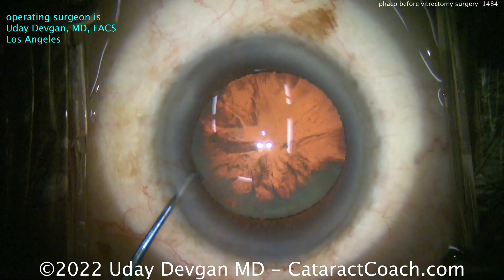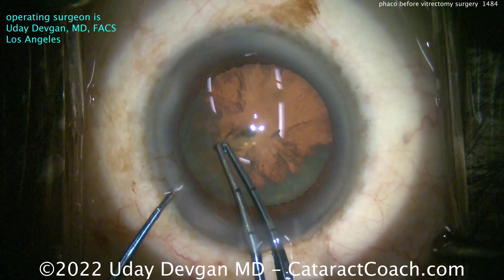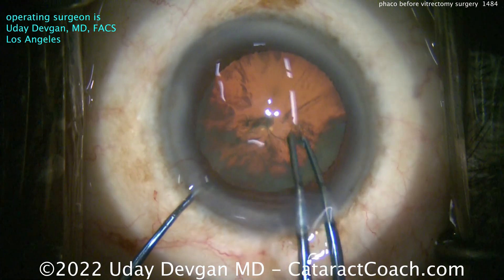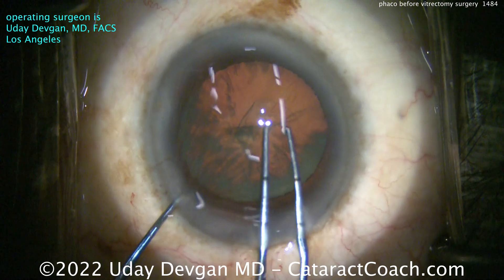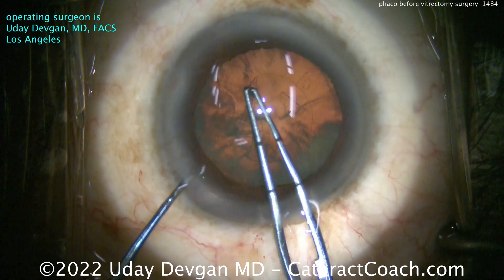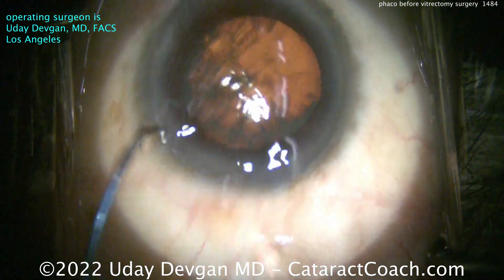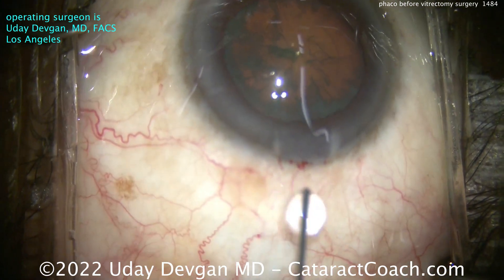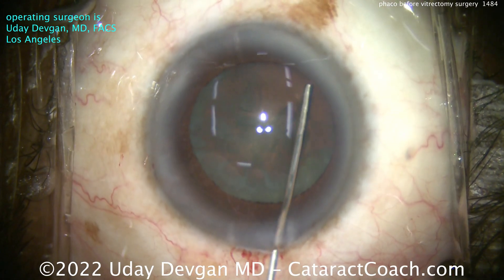Step two is to make the capsulorhexis a little smaller than you're used to. While I normally like a five millimeter rhexis, I'm going to aim here for about a four and a half millimeter rhexis. I want the optic of the IOL to be very securely overlapped by the anterior capsulorhexis. The reason is, in the post-op period of my surgery and the retina surgery, if you're going to put a gas bubble — C3F8, SF6, or even just air — that can exert a posterior pressure, and I don't want that posterior pressure to push the IOL optic out of the bag.